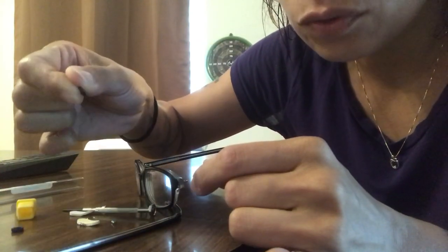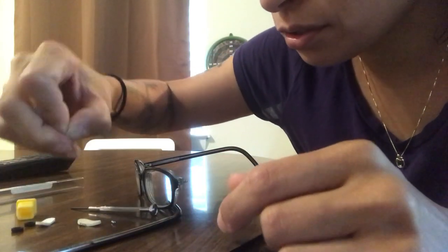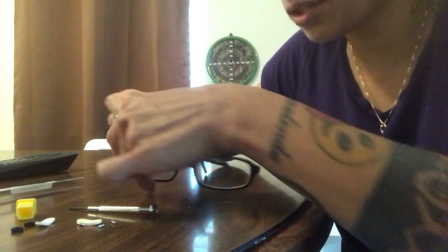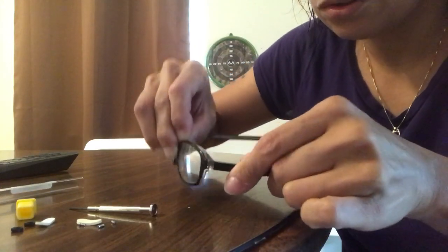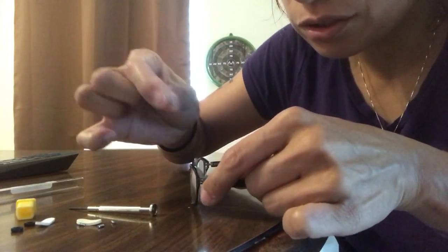There are some things in here that I don't know what they're for — little rubber band-looking things. There are three different sizes, or actually four, of these little tiny screw things. I think the biggest one is the right size for mine. I'm gonna go ahead and put the glasses together the way they go and then just stick this in.